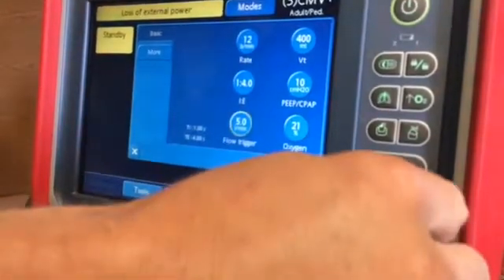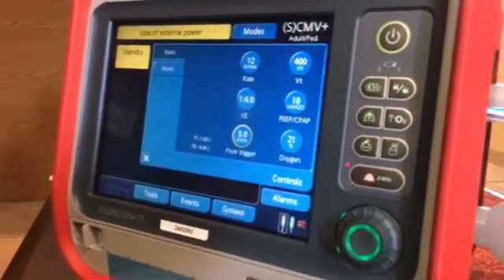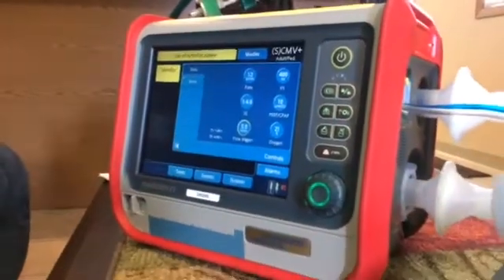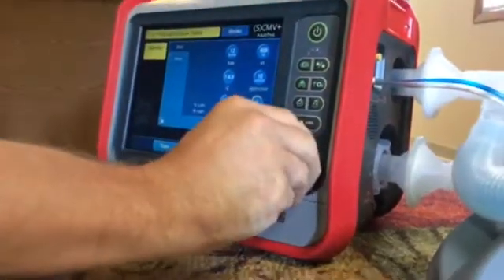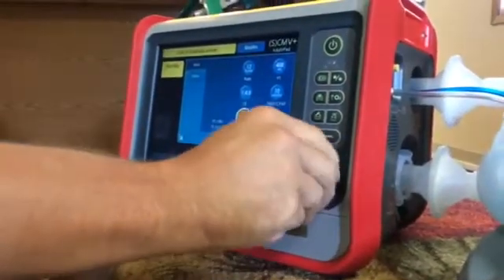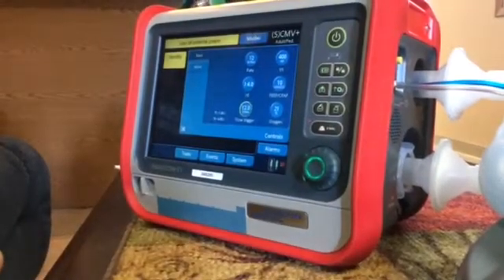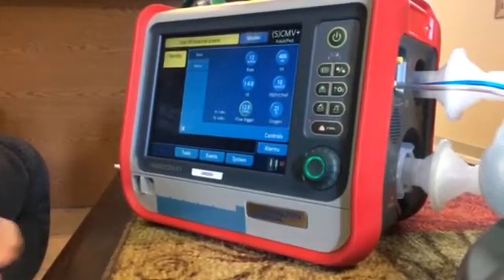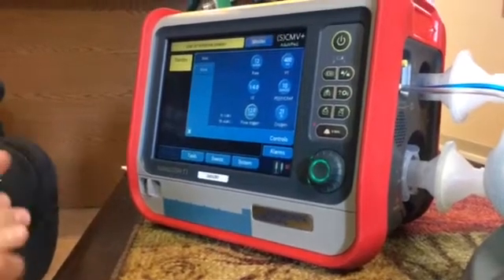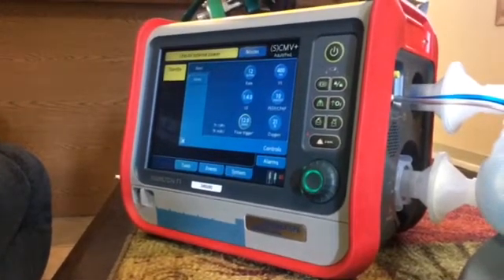The only other thing is Dr. Parumba wanted us to use a flow trigger at 12. That was driven from other programs to minimize the amount of auto-cycling that happens with this ventilator. Although I feel that in the future we'll be able to reduce that, we're going to go to 12 for now and see how things go.